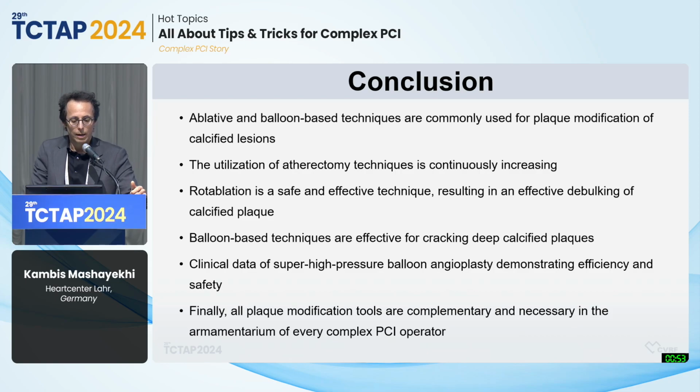So to conclude, ablative and balloon-based techniques commonly used for plaque modification of calcified lesions are complementary. The utilization of atherectomy techniques is continually increasing, as you have seen and as you notice in your daily practice. I think rotablation is a safe and effective technique, resulting in effective debulking of calcified plaques. The balloon-based techniques are effective for cracking deep calcified plaques as well. We also have newer technologies like shockwave. I didn't go into the detail here.